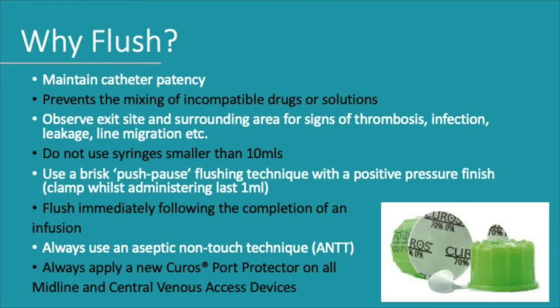Okay, flushing, super important for any of our lines, PICC lines, cannulas. We must flush the line properly, making sure that we are having that positive patency. We don't want any medication left in the line or blood. This can cause a huge risk to the patient. You can have blood clots, infection risk, and potentially even septic shock. So before medication, flush the line. After medication, flush the line. And definitely after bloods as well, taking any bloods. We also want to be making sure that any of our central lines need to have Kuros bungs placed on the end of the lines as well.